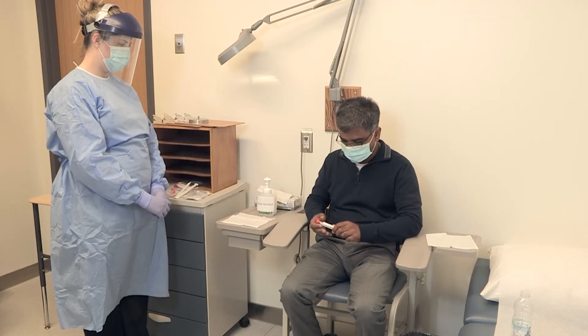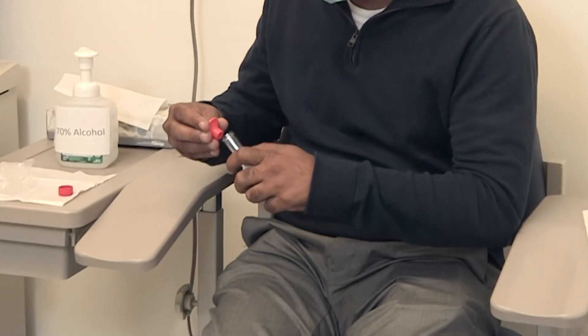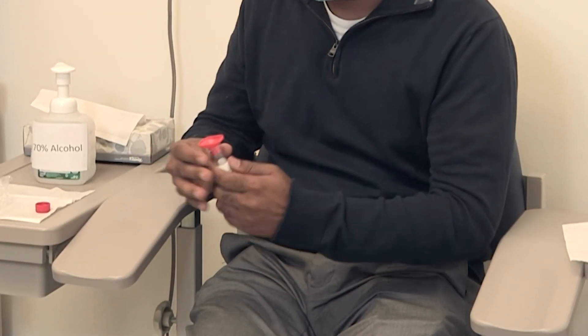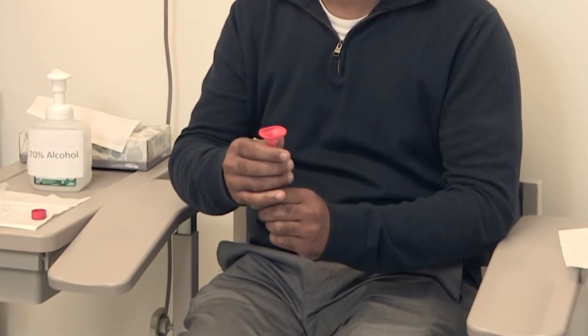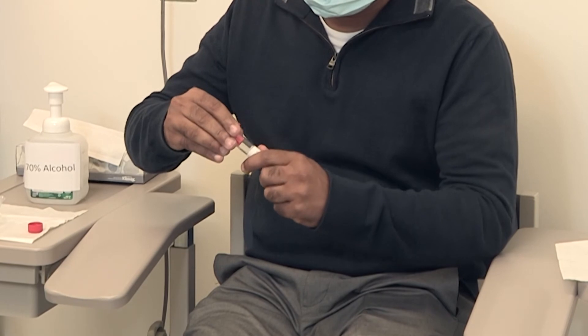If you are using a funnel, take it out of its packaging. Next, you or the healthcare provider must push the funnel into the top of the tube. The funnel should fit snugly into the opening of the tube.